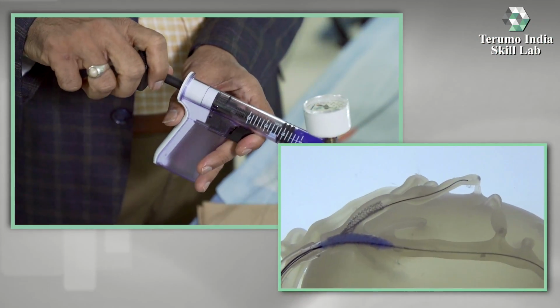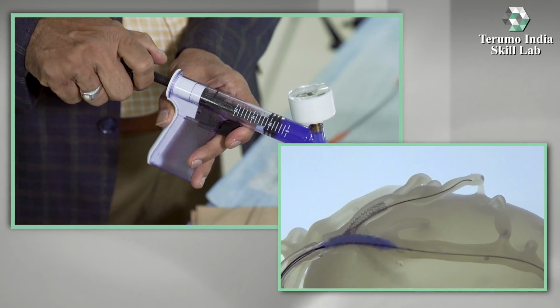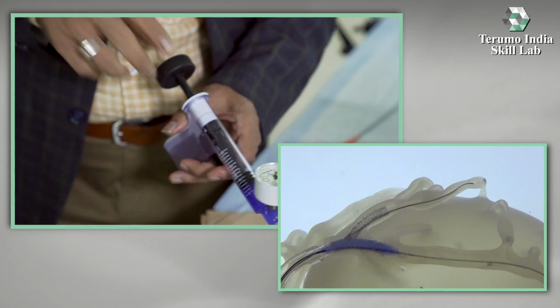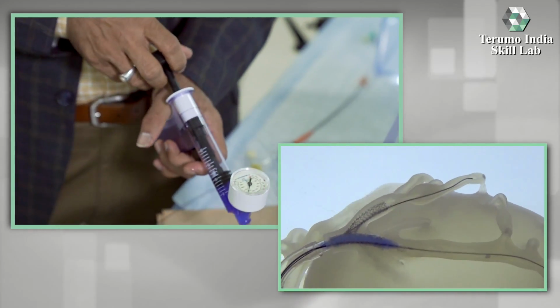So I need a 4 mm balloon to optimize the proximal part of the stent.